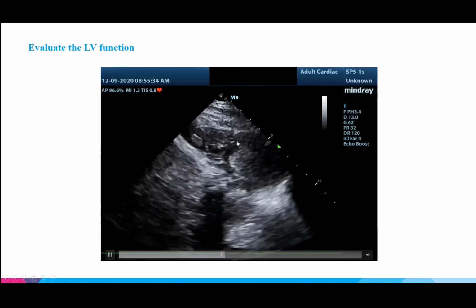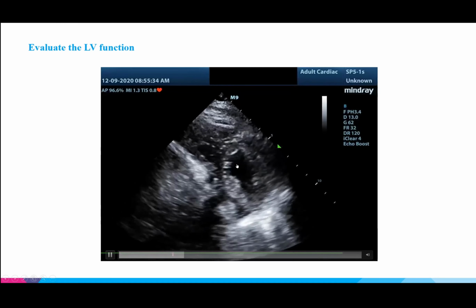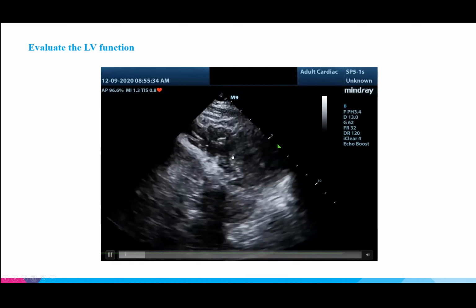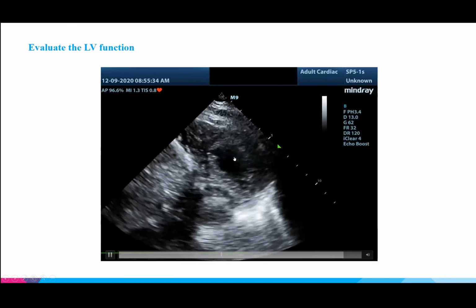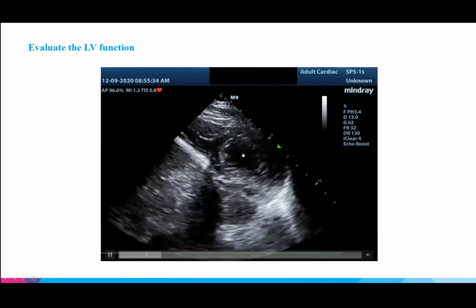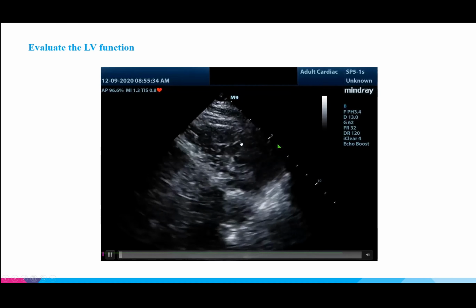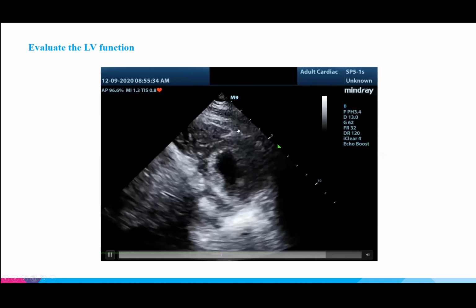But from what we can see here, if we look at the cavity, the anechoic fluid-filled left ventricle cavity, with contraction, it completely obliterates, completely goes away, right? So certainly the diameter of the cavity size shrinks more than a third. It probably goes all the way to 0. So this view would denote hyperdynamic LV function, which most of you guys agreed. So that's excellent.